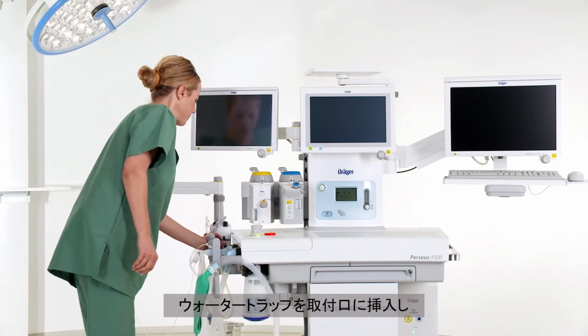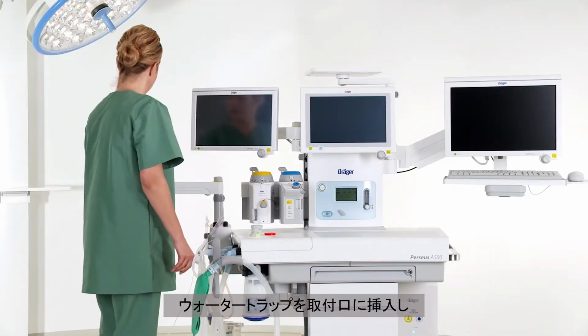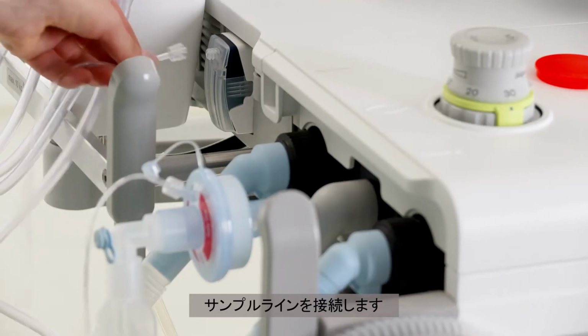Insert the water trap into the receptacle and connect the sample line.